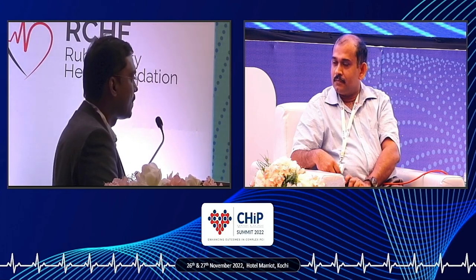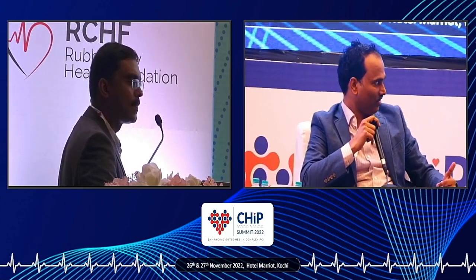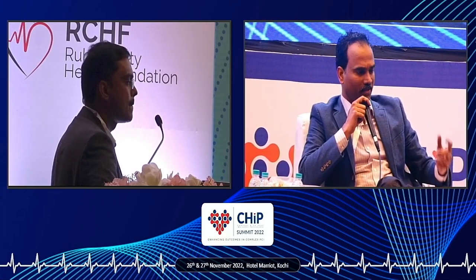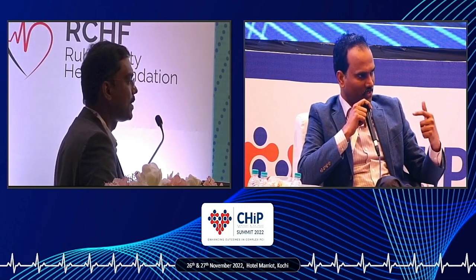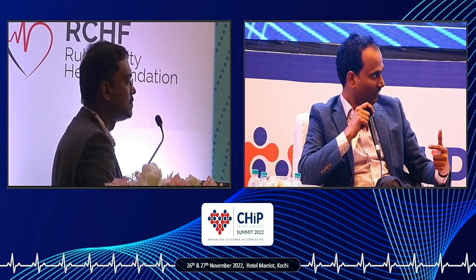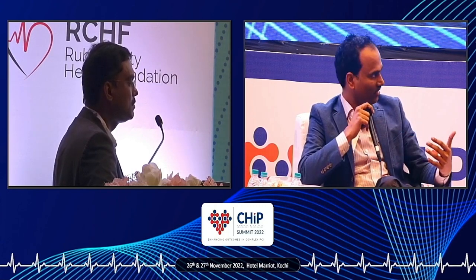I'll add a couple of things. You asked about when do you select laser in such situations. See, it's again based on the pathology. If the pathology is predominantly intimal hyperplasia, then I think that's where the laser comes as a rescue.